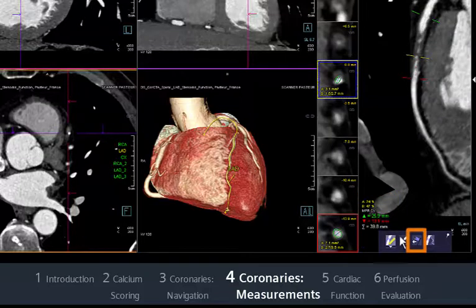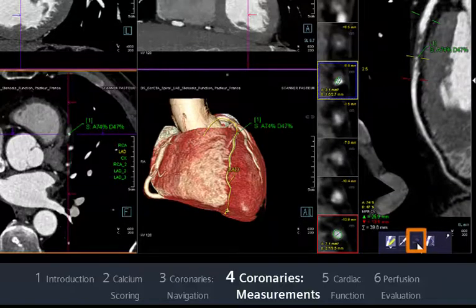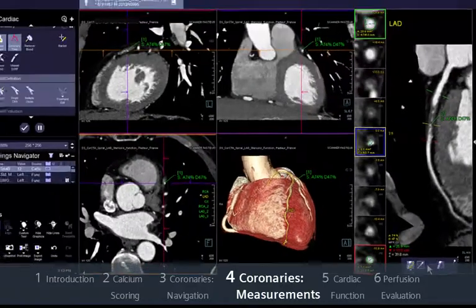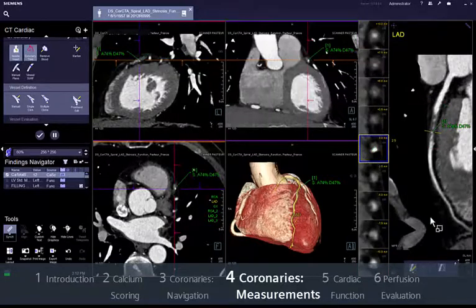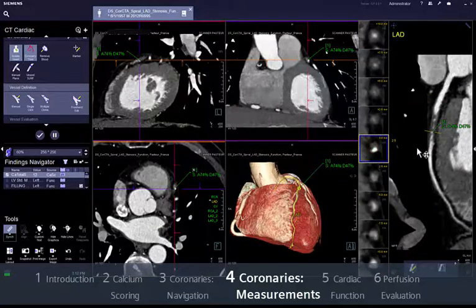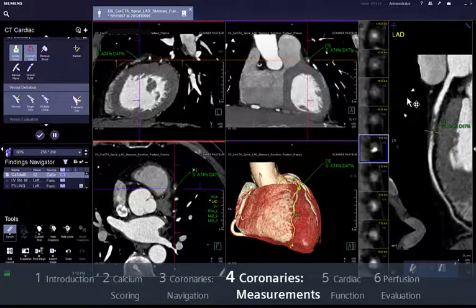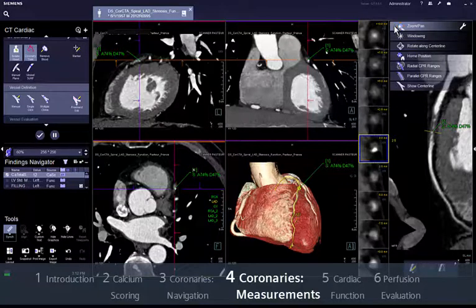Click on the 'Create Finding' tool if you want to send the measurement to your findings navigator for further archiving. For reporting purposes you can easily create radial CPR ranges with the corresponding function in the upper left corner menu.